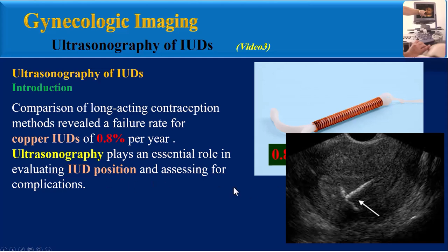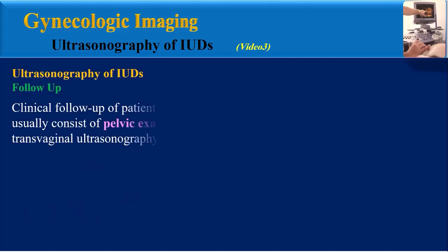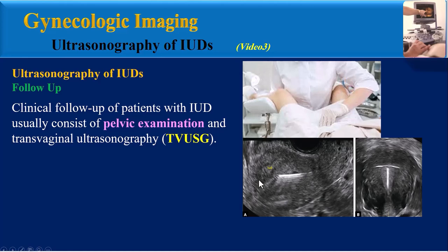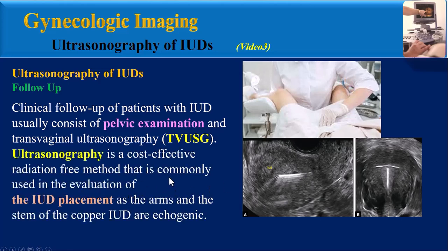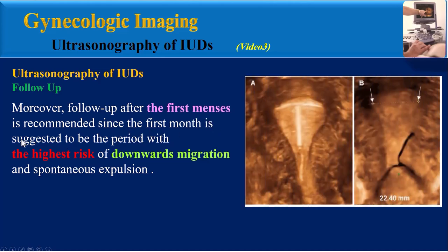Ultrasonography plays an essential role in evaluating IUD position and assessing for complications. Clinical follow-up of patients with IUDs usually consists of pelvic examination and transvaginal ultrasonography. Ultrasonography is a cost-effective, radiation-free method that is commonly used in the evaluation of IUD placement, as the arms and stem of the copper IUD are echogenic.